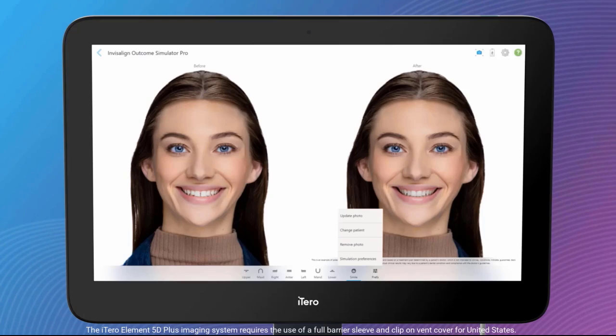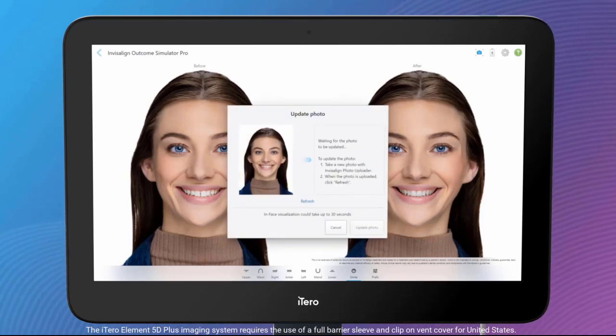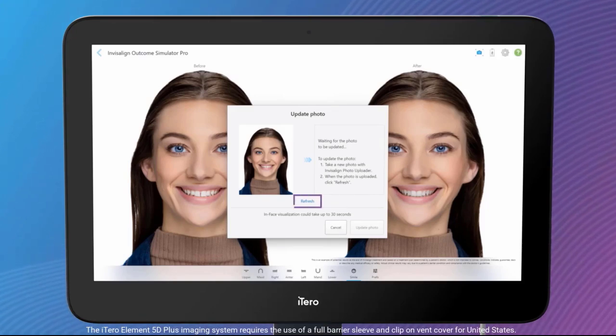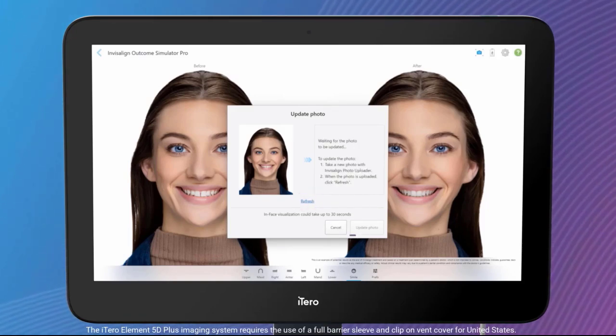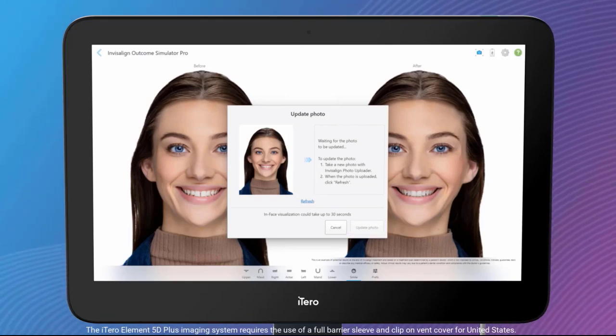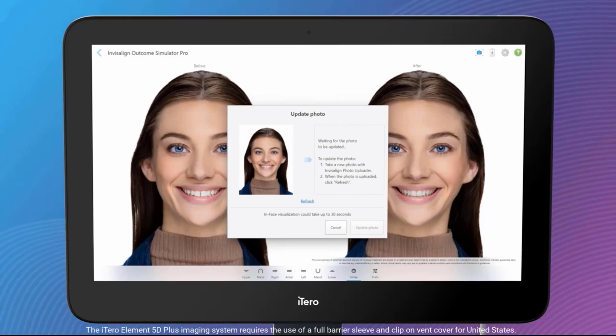The patient photo can be updated. Tap on Update Photo. Next, retake the photo using the Invisalign Practice app. Tap on Refresh if the updated photo doesn't appear, then tap on Update Photo. Select the new photo. The simulated smile will be regenerated in about 30 seconds with the new photo.